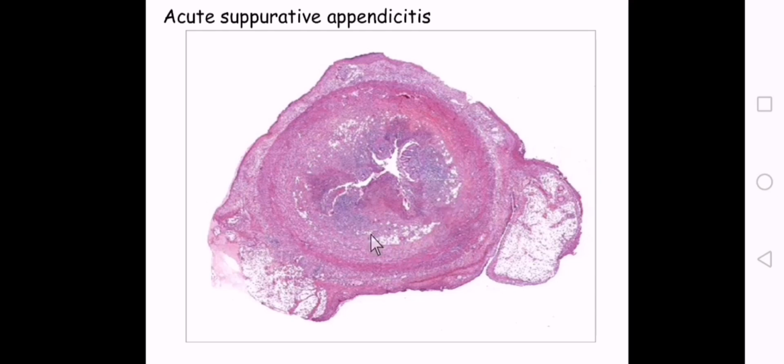طبعا انا جاي اعيد حتى بلكي تحفظون وياي. plus هاي ال inflammatory process even reached to the peritoneum، للسبسيروزال layer وللبريتونيوم. فالبريتونيوم هنا هم shows edema and infiltration by inflammatory cells، وحتى هاي تشوفون dilated congested blood vessels. فهذا البيشنت وصل من الأكيوت suppurative appendicitis حتى وصل peritonitis.